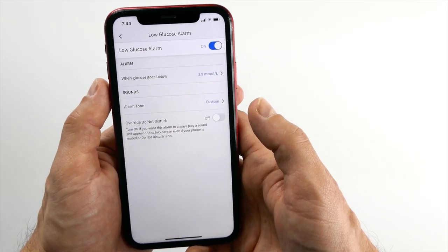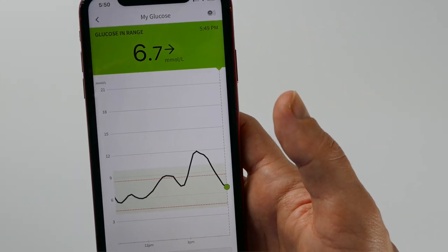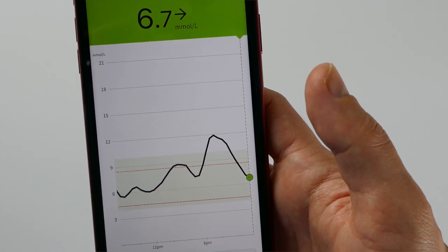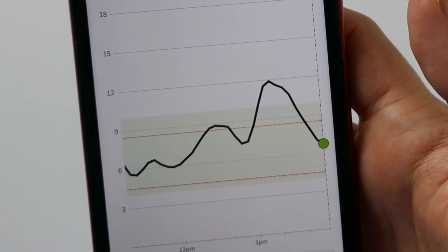You can also deactivate any of the alarm types completely if you don't want to be disturbed during sleep or an important meeting — but be careful because your blood sugar might not like that. One important thing: setting the alarm levels will not change your ideal range levels that you previously set. You will see the alarm levels as red dotted lines and the ideal range as the green area on your home screen.